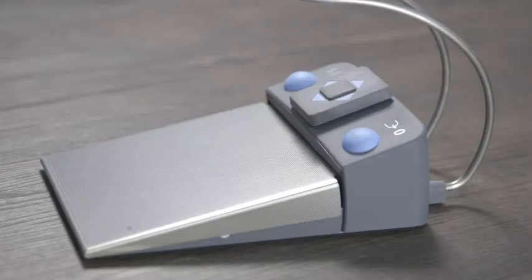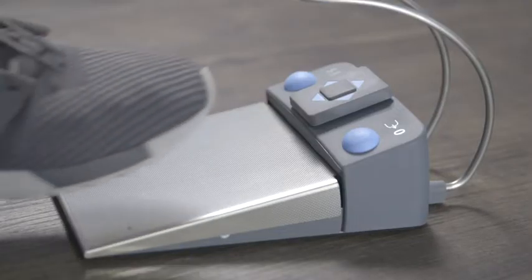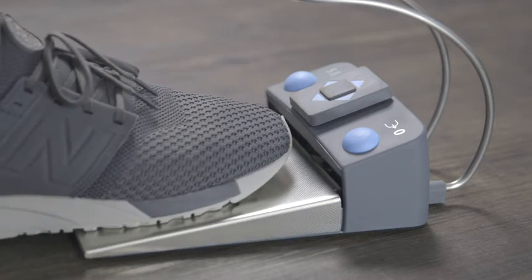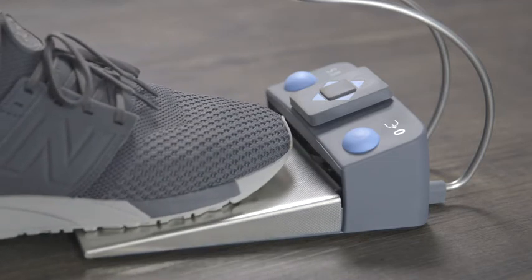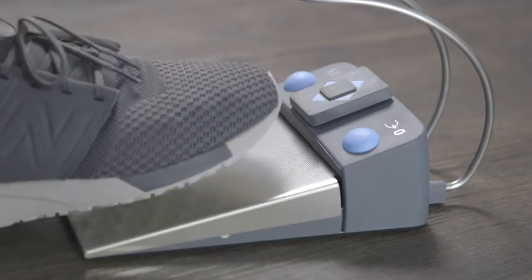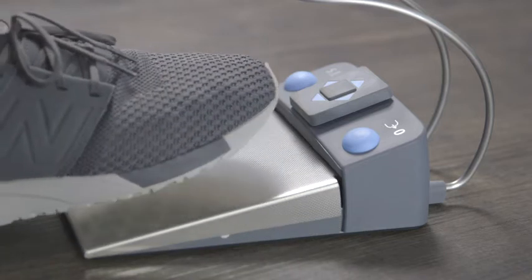The foot control can be used as a direct starter or speed foot control. As direct starter, the instruments are activated or deactivated when the foot control is pressed.